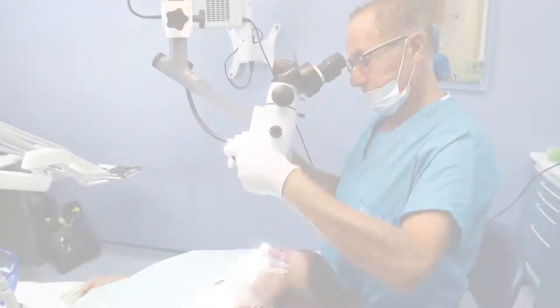Once isolated, an access cavity is made in the center of the tooth to reach the pulp space and allow location of the small canals within the root.